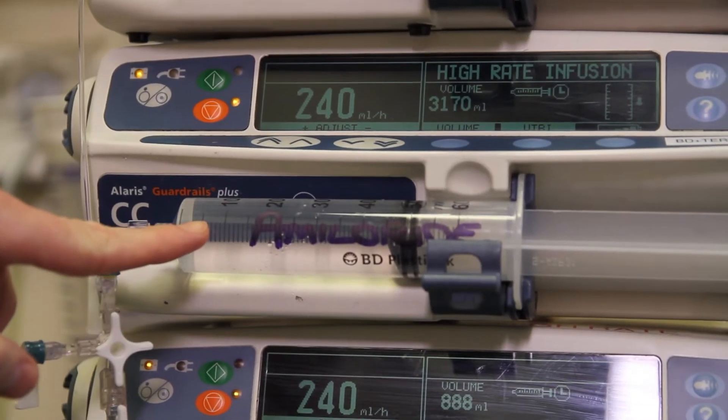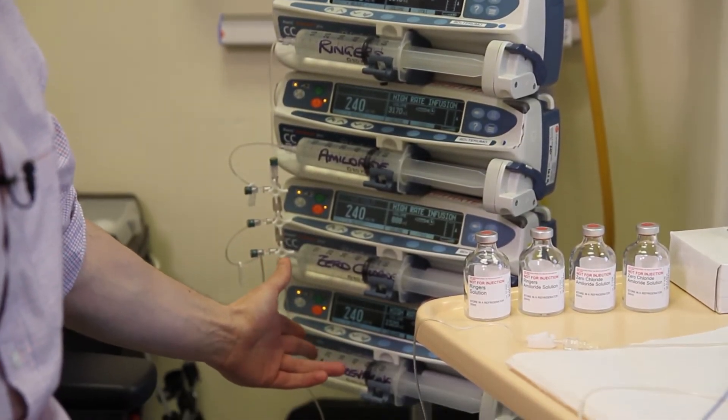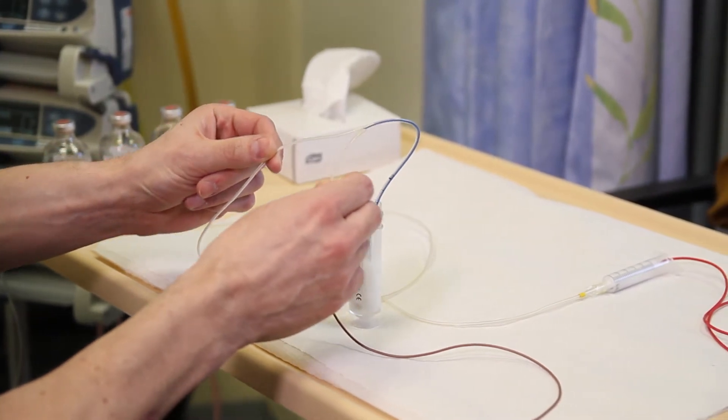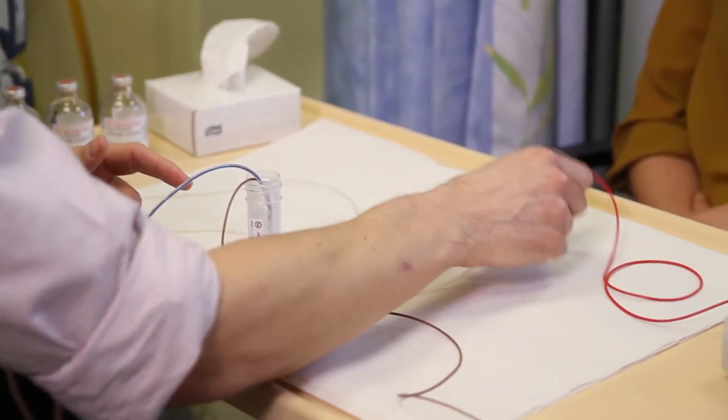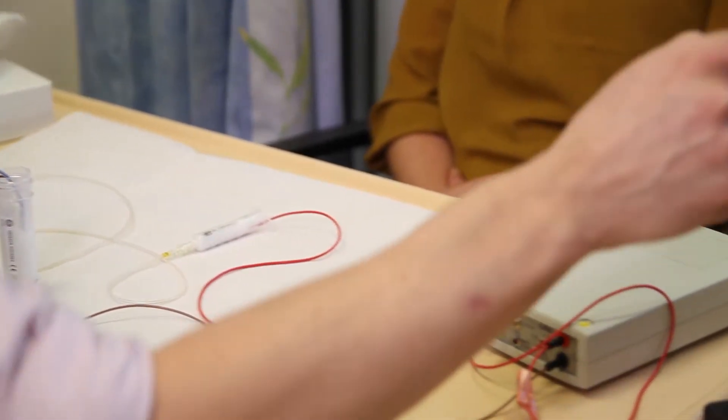The catheter is the center of the test and divides it into two sections. One involves the infusion of Ringer's, a Ringer's amiloride, a zero chloride, and a zero chloride with an isoproterenol solution, which perfuses through a three-way tap system through the catheter. The other aspect of the dual chamber catheter is a recording electrode, which feeds into a micro voltmeter with an output recorded on the computer.